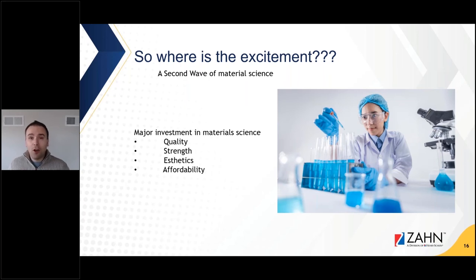Everybody's working really hard to come up with sort of the ultimate material for printing dentures. Why? It is much easier for vendors to give you a liter of tooth resin and a liter of denture resin, sell it to you, and then you go ahead and 3D print it. You don't have to worry about inventory so much, like you have to with carded teeth and deliveries. It's also more efficient. It's easier for you to produce it that way and keep stock of resin, not necessarily denture teeth. And overall, we want things done, as always, quicker, faster, better.